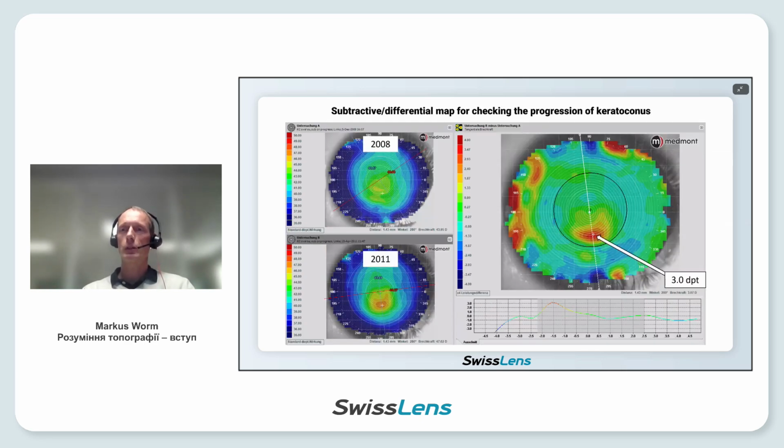With a differential map, you can also see quite well the progression of keratoconus. In this example, the topographies from 2008 and 2011 are compared, and you see a progression of 3 diopters over the time at the apex. So as you have seen, you can do a lot with this differential subtractive map.